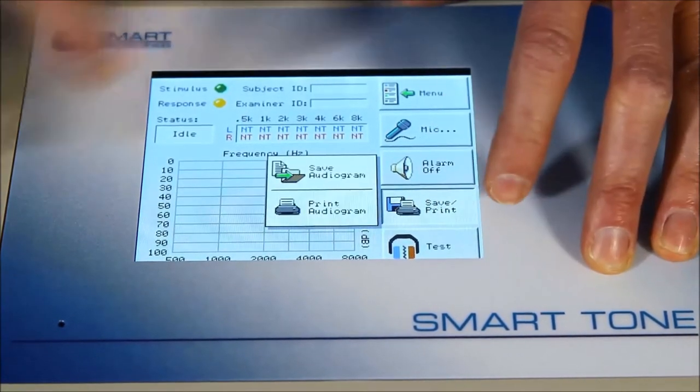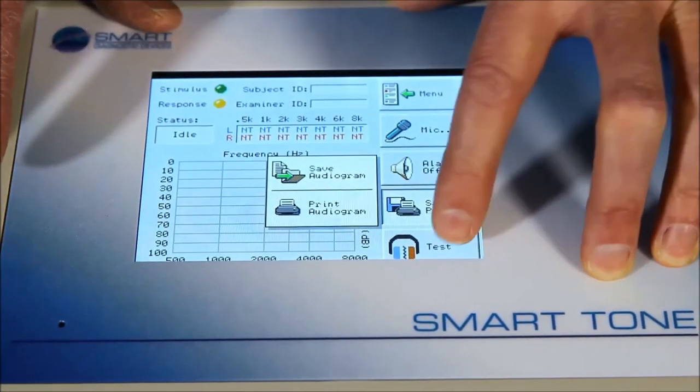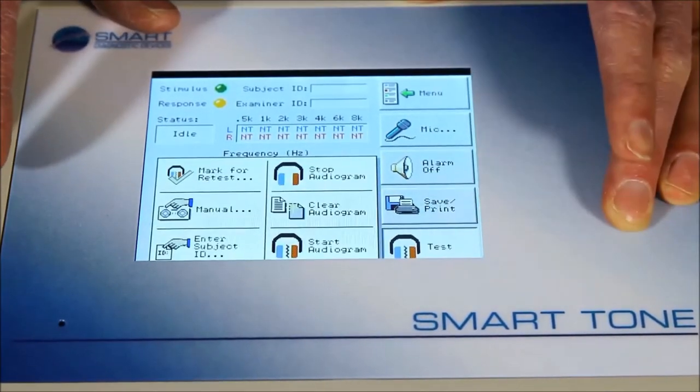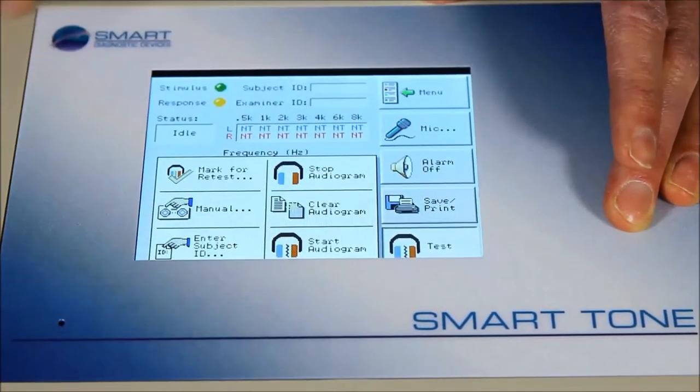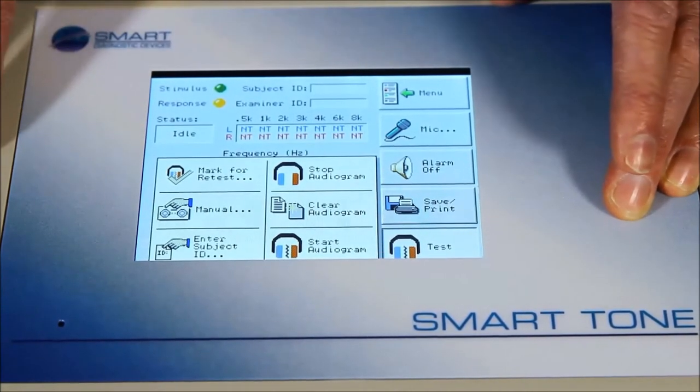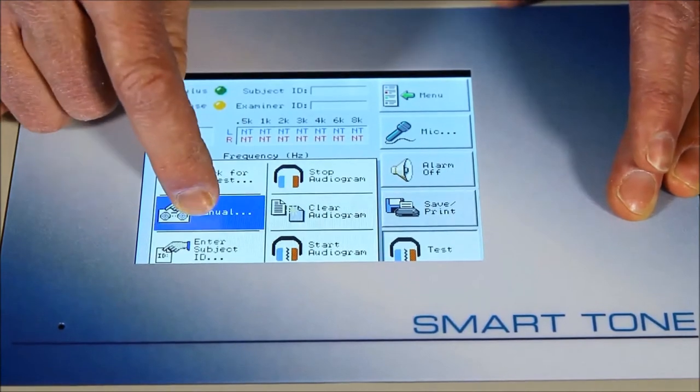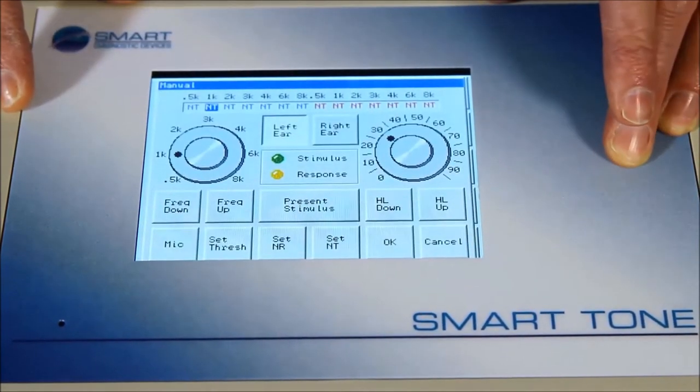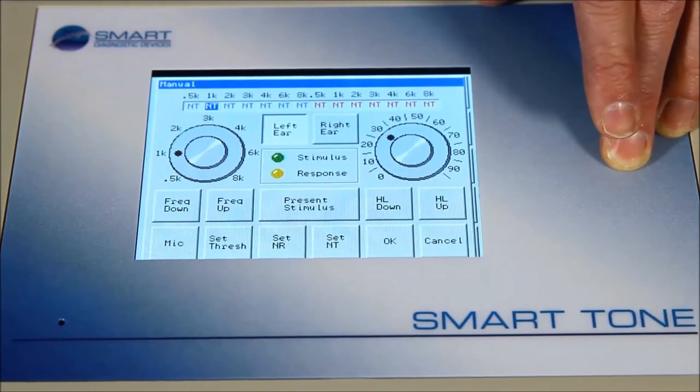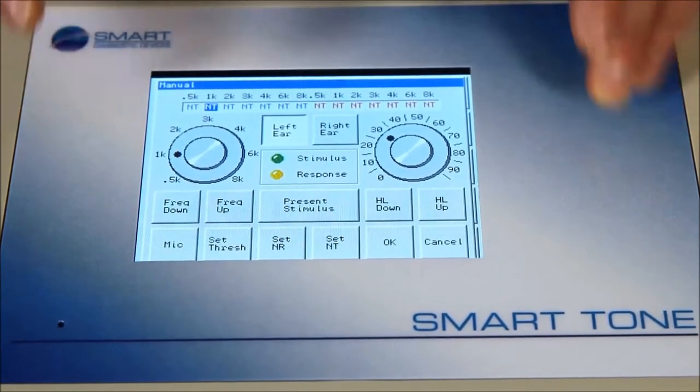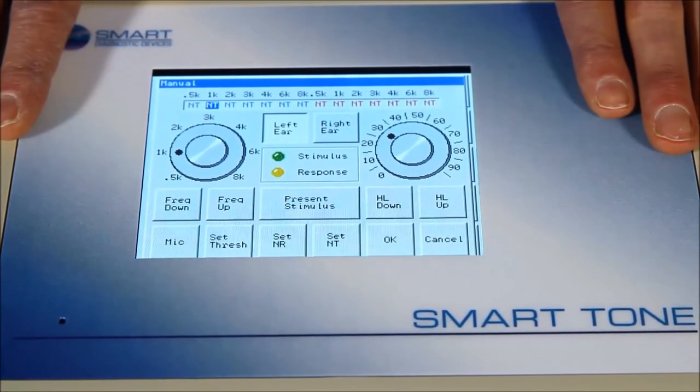And then at the end, when you have a test, you can save it or automatically print it. The test button allows us to start a test, stop a test, clear a test when it's done, enter the subject ID, or go into the manual mode where you can present the tones and the different sound levels manually if someone's struggling with a test.